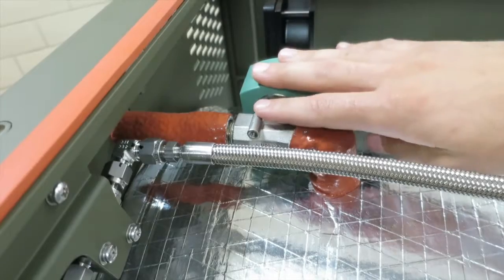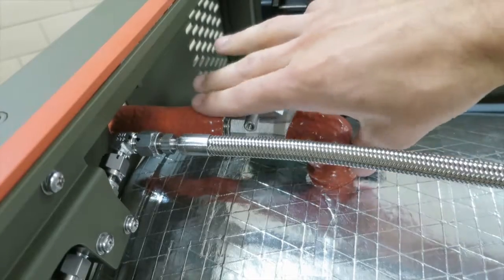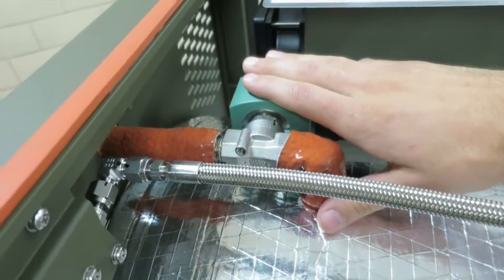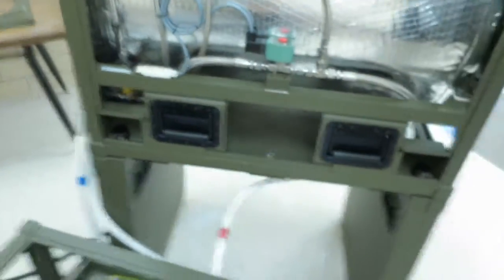So this valve is very important to the operation of the sterilizer. It's also very important for vacuum leak tests. This valve is very suspect if you possibly have a vacuum leak. So that's it for the top of the sterilizer, and we'll move around to the front and talk about it.